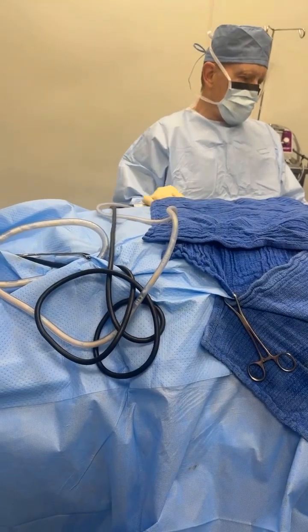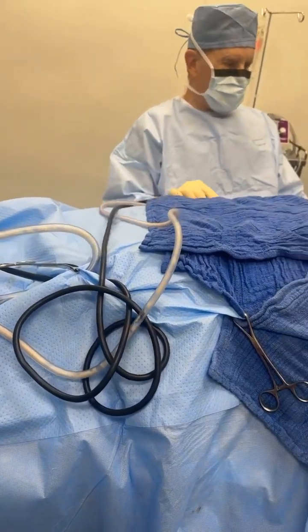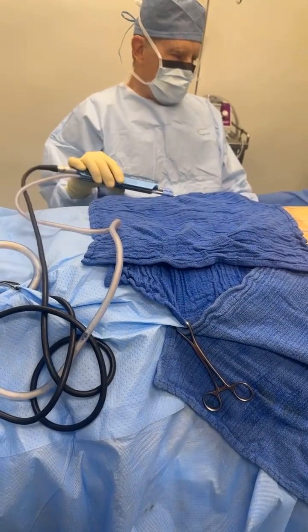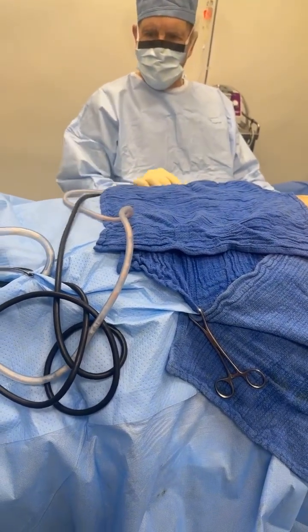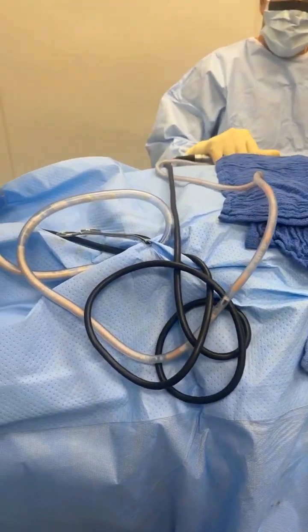In my career with power-assisted liposuction, notice that my strokes are, I would say, much slower than most doctors, and less trauma to the tissues, and a very nice output as a result of that.